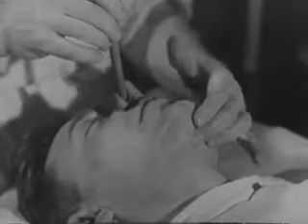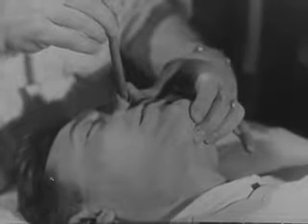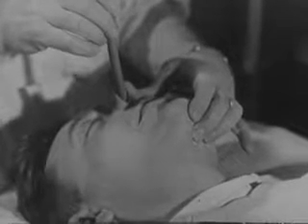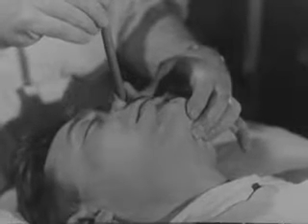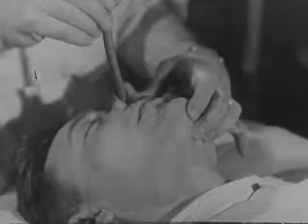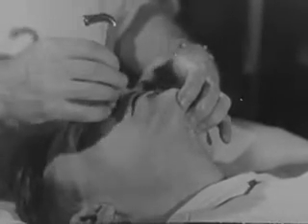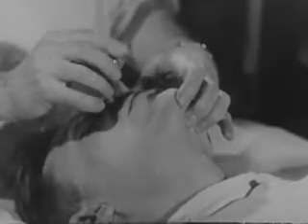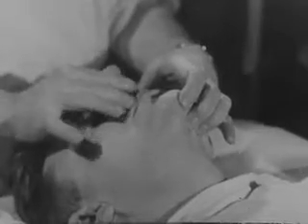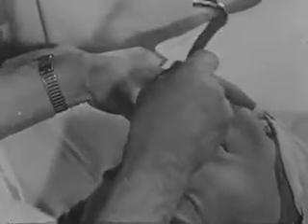But if the breath sounds diminish in intensity, the tube is no longer advancing towards the glottic opening. The tube is then withdrawn a little and rotated slightly. During the rotation, the distal end of the tube should pass over the glottic opening. The breath sounds suddenly increase. The rotary movement is arrested and the tube is slipped in. Here again, we repeat the blind intubation done at normal speed.